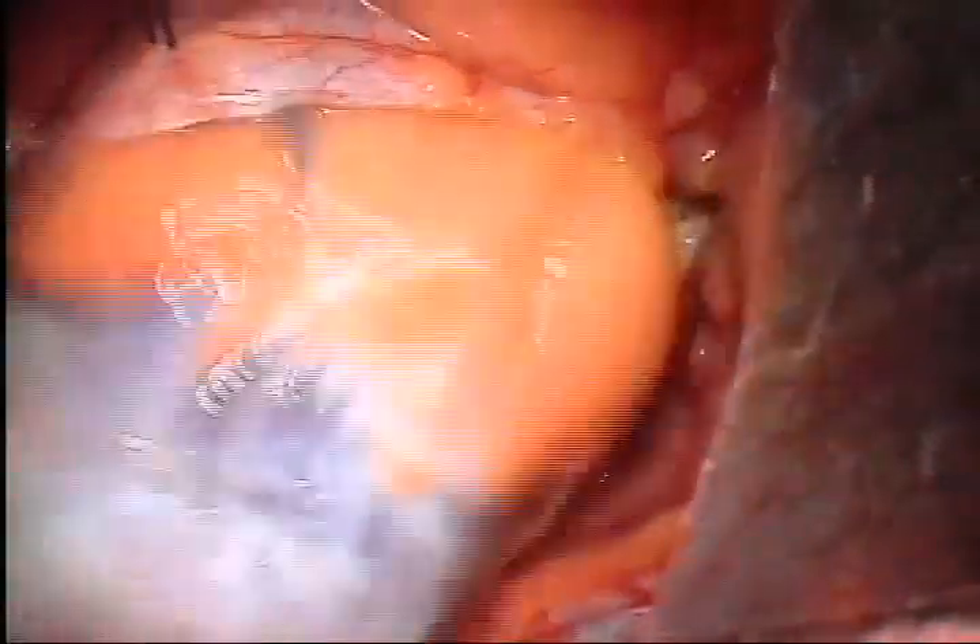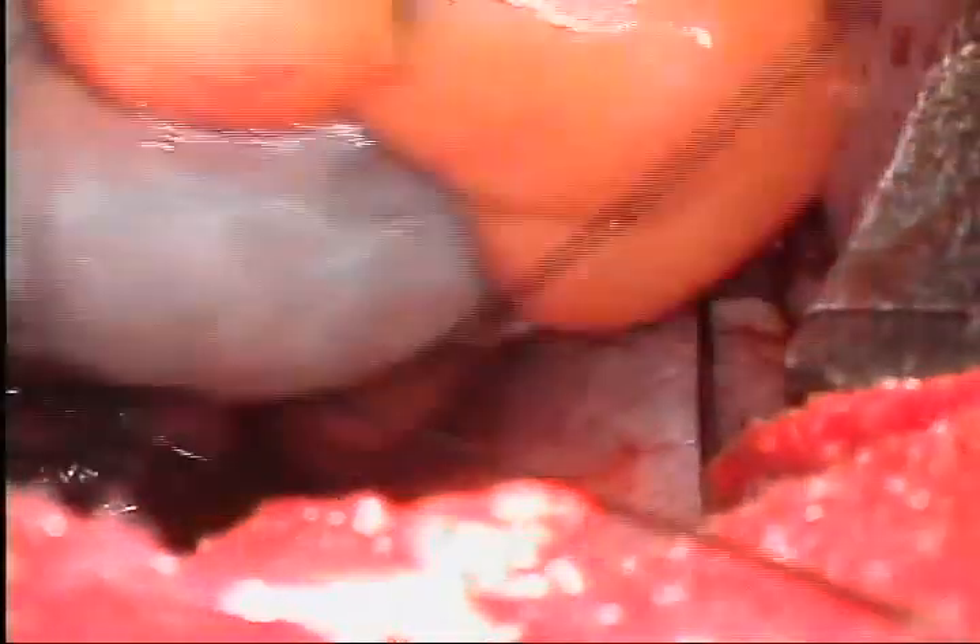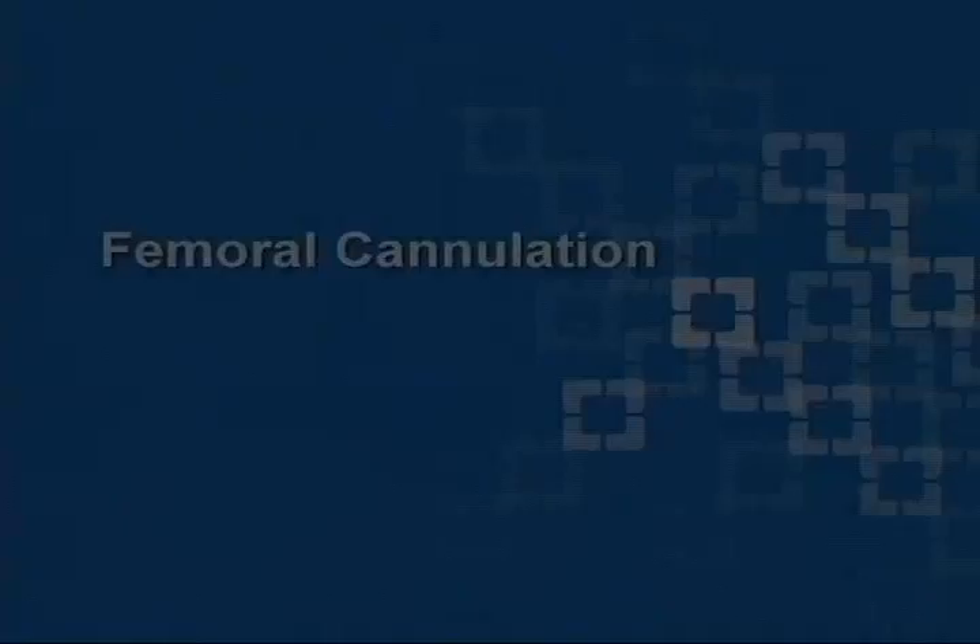Two or three pericardial stay sutures are placed, generally one at about the level of the inferior vena cava and one near the superior vena cava. These are pulled out through the chest wall using a crochet hook. With the pericardium distracted, the pulmonary veins are easily visualized by pushing the right atrium toward the patient's left. This ensures that we are in the correct inner space.